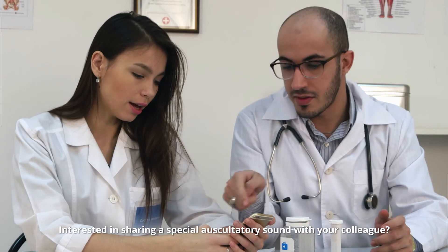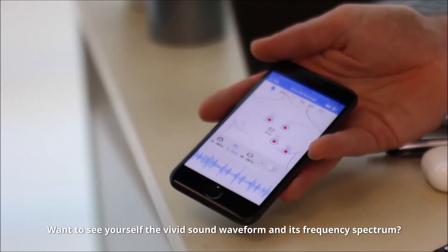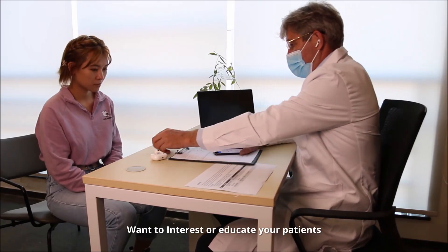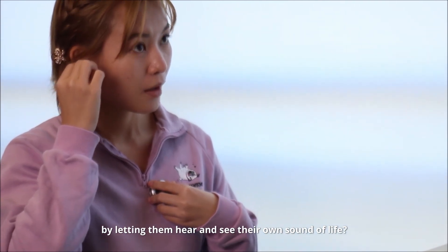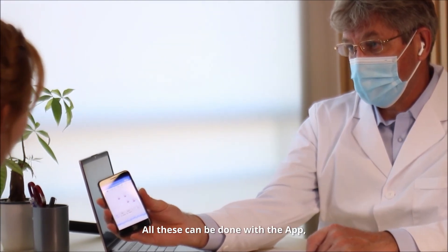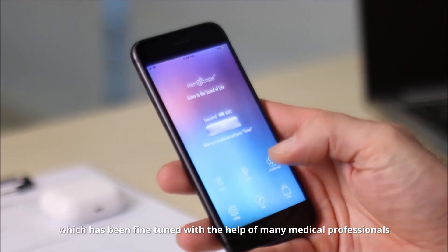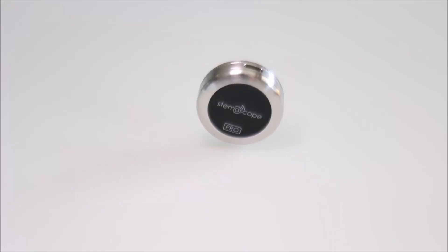Interested in sharing a special auscultatory sound with your colleague? Want to see the vivid sound waveform and its frequency spectrum? Want to educate your patients by letting them hear and see their own sound of life? Or simply have some sounds for research and reference? All these can be done with the app, which has been fine-tuned with the help of many medical professionals since its launch two years ago.